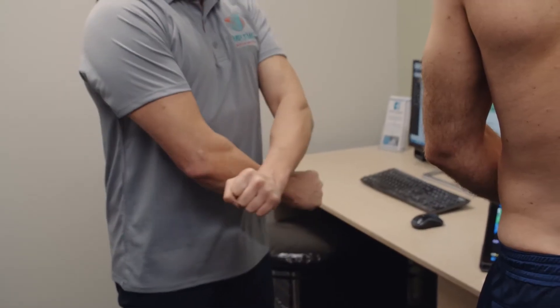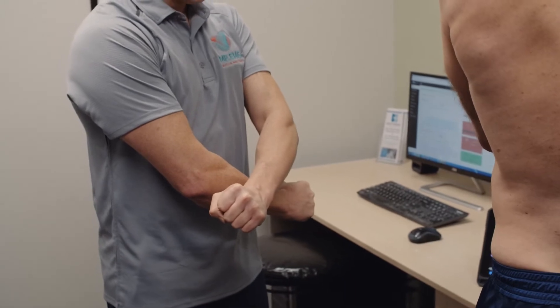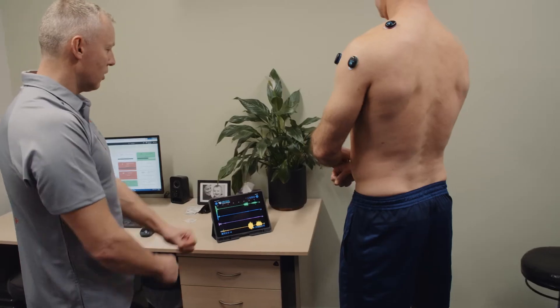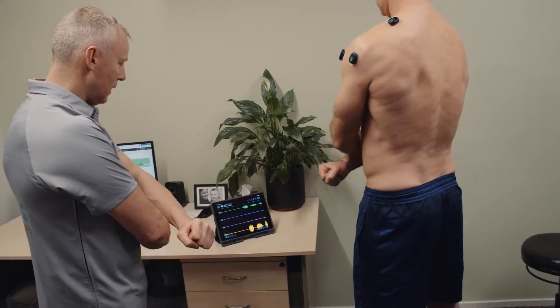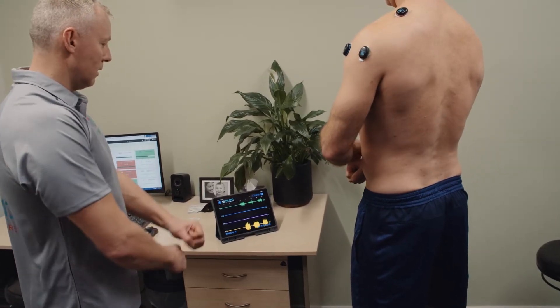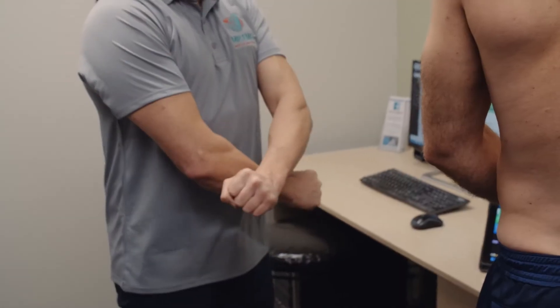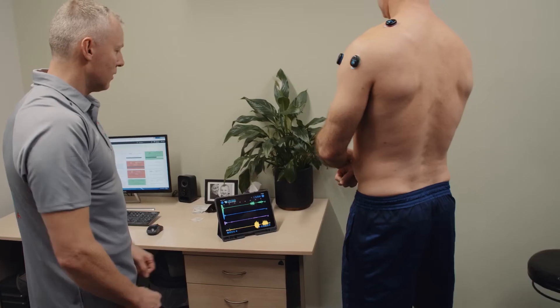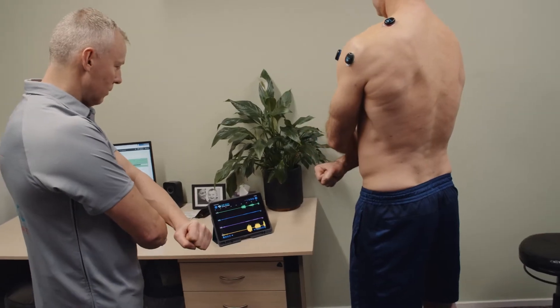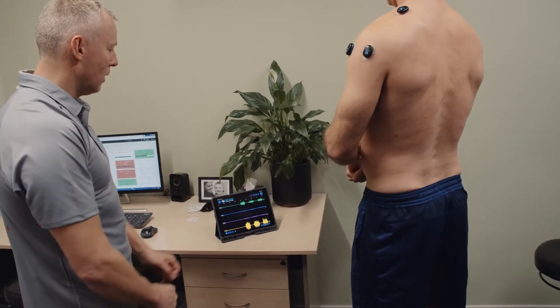Now show your subject how to perform a maximal voluntary contraction of the pectoralis major using Mr EMG biofeedback. Now record your subject performing three maximal voluntary contractions of their pectoralis major simultaneously.